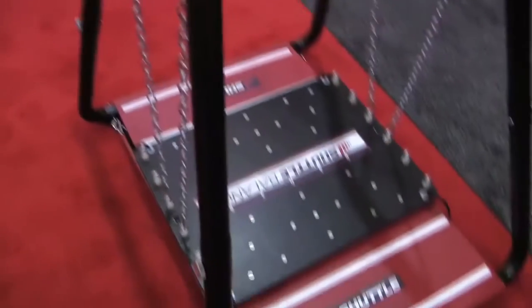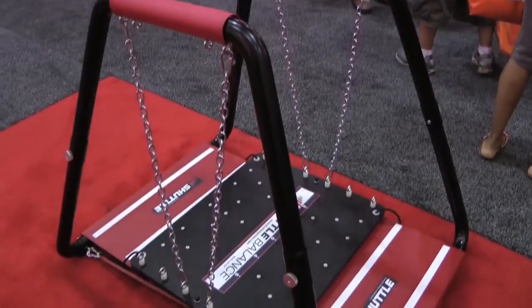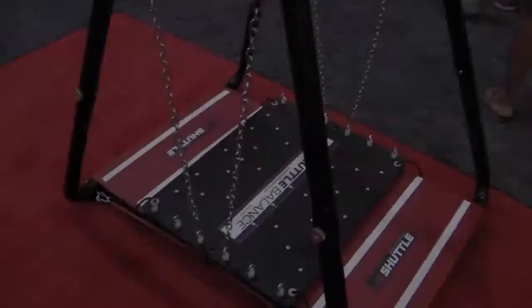I'm a student athletic trainer and recently one of my athletes had an ankle sprain. He's a throwing athlete, so for part of his rehab we use the balance system. We have him stand in the middle of the board and balance on one ankle at a time, then go through his throwing motions. We make it harder by moving the chains in, and we can also elevate the board. He goes through his throwing motion with either a ball or a weighted small medicine ball and we toss it back and forth. He tries to sustain the single-leg stance through five tosses, and if he misses one we have to start over.